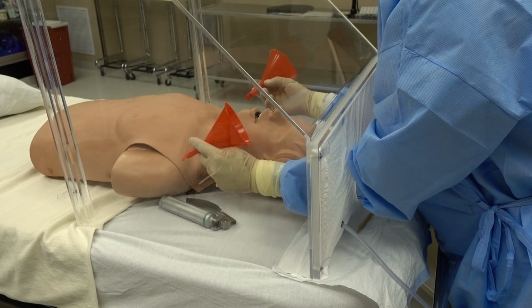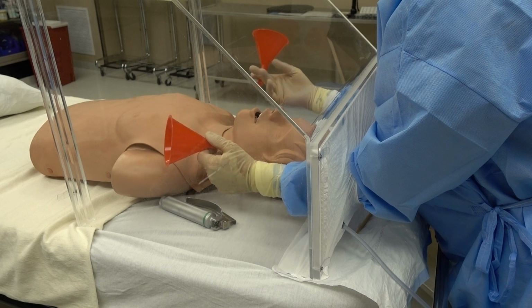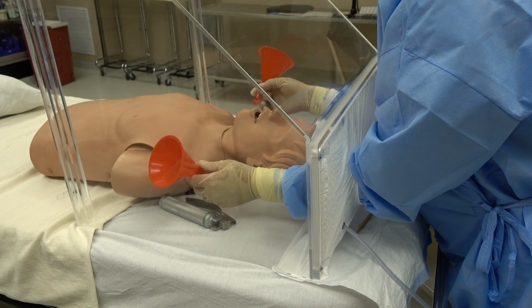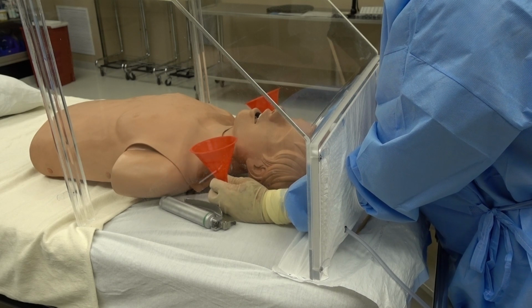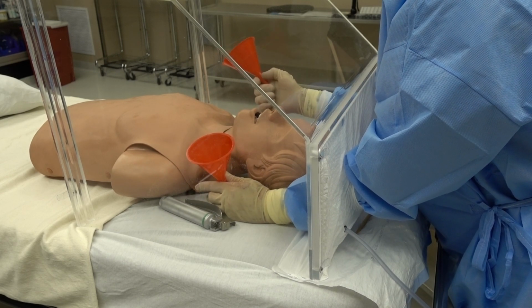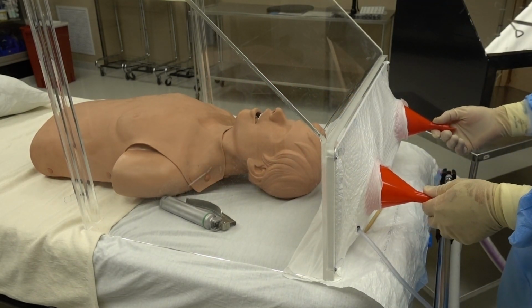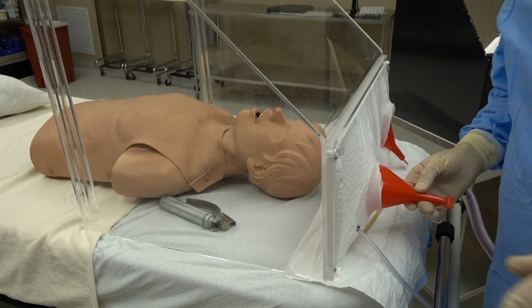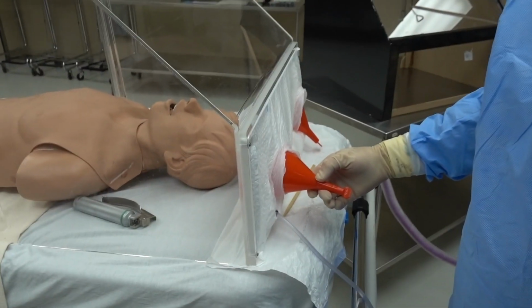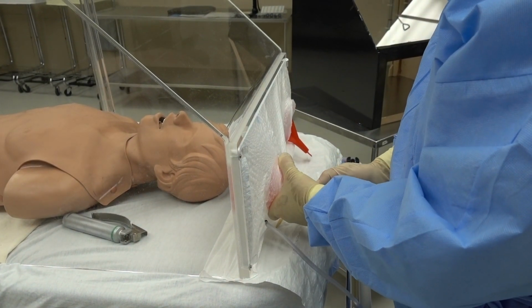So to come out, we just got simple funnels. You can buy these for, gosh, 50 cents a piece. You can buy a whole set of them for under $2 at one of the tool shops here in town. These have been melted. These have little handles. When you come out, you literally just pull them out like that, and they'll seal, and you just tape around them. And you can even take the tape off and go back in if you wanted to do something. But they'll seal very nicely with tape.